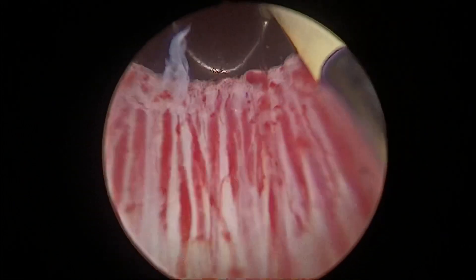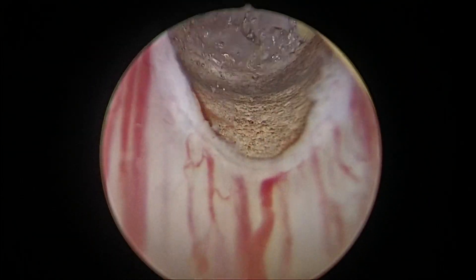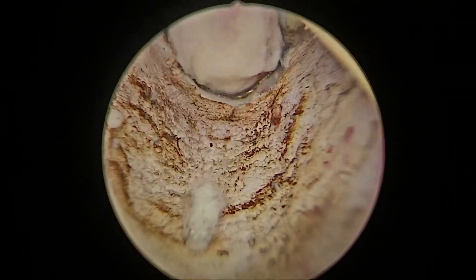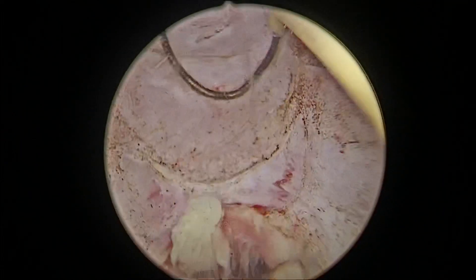Initial cystoscopy is done which looks normal. Using a 26 French TOR sheath, the prostate was resected starting from the neck. We tried to preserve the neck as the patient was very young. As the abscess was in both lobes, as we went a little deeper, we could see frank pus coming out of the prostate. So in the same area, we resected more and de-roofed the abscess.